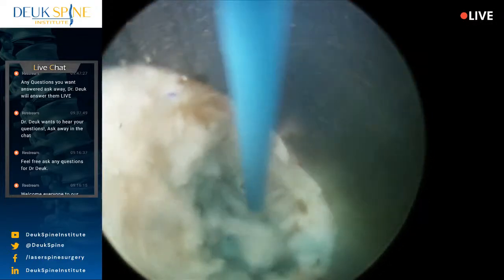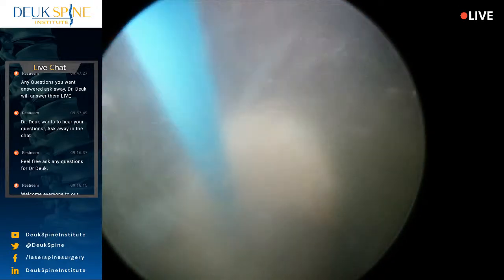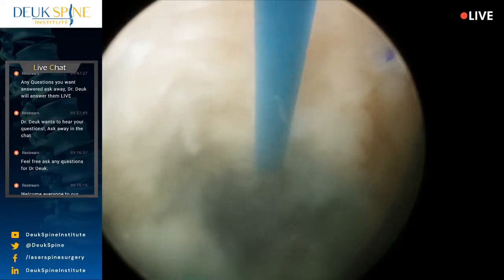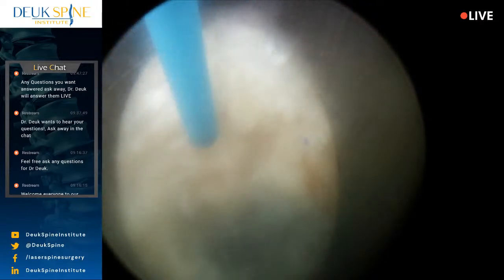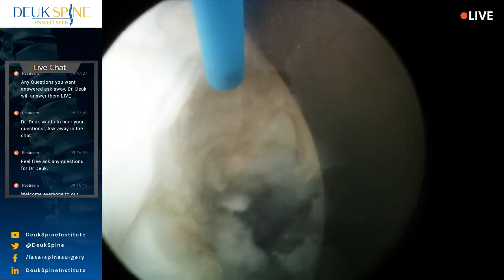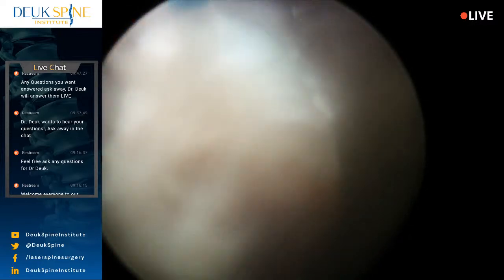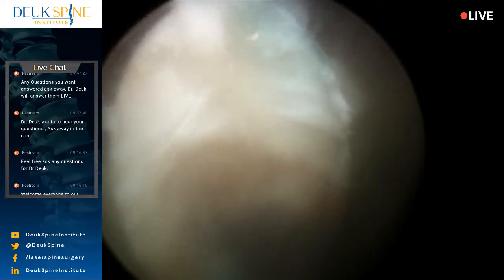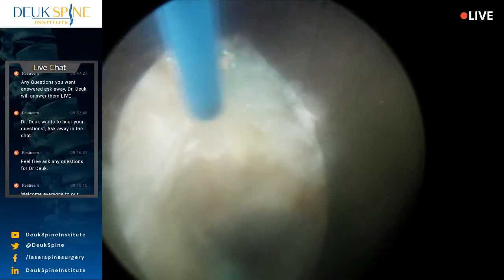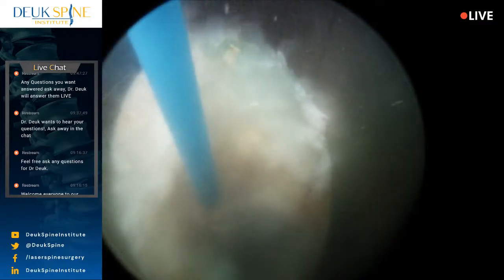Okay, anyway, it's that nuclear material that's blue that's been worked over by inflammation in this patient for a long time. You don't get that blue staining unless there's been inflammation affecting the nucleus pulposus, and inflammation destroys tissues. That's what it does. It destroys things. So there's been a destructive force working on the nucleus pulposus over a long time here. And that destructive force is basically like bleach. It's a chemical milieu released by cells called polymorphonuclear leukocytes, or PMNs. Neutrophils is another name for them.